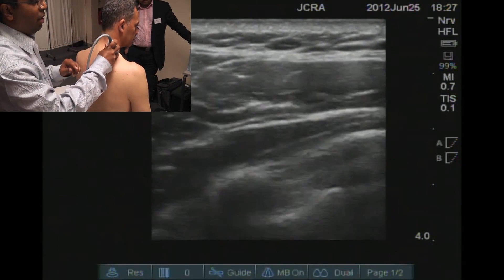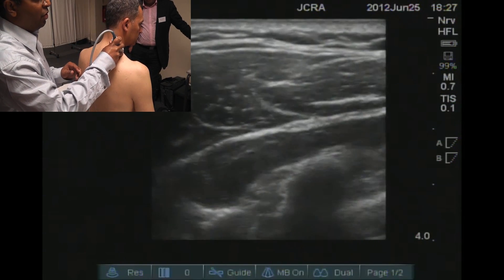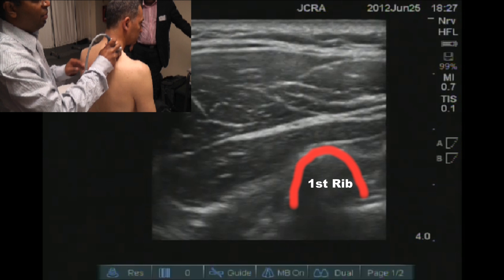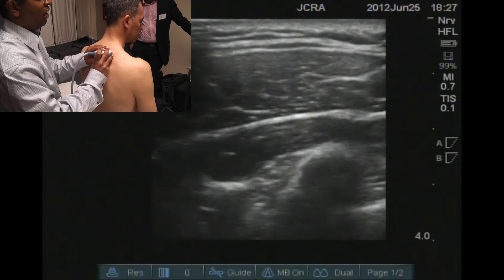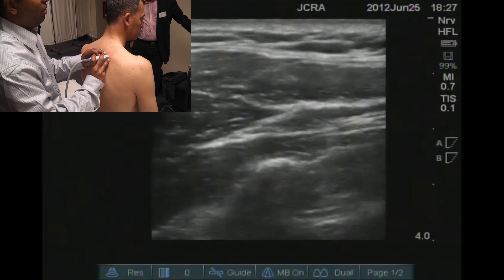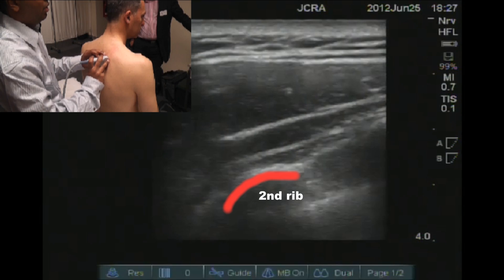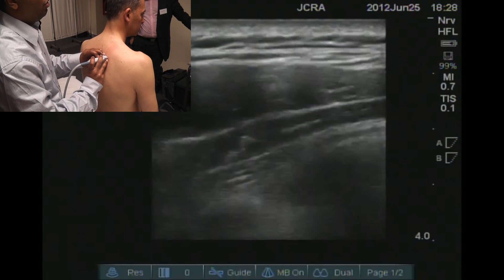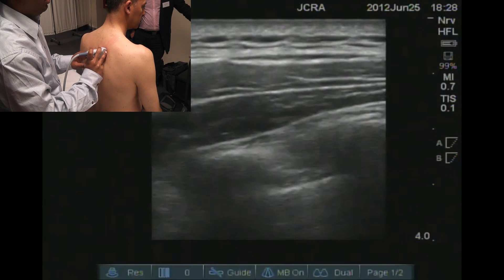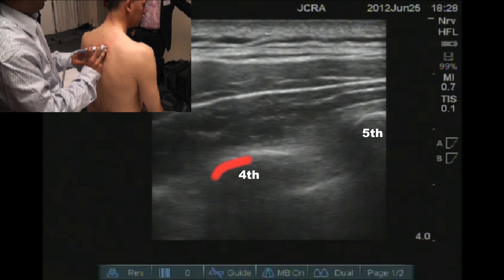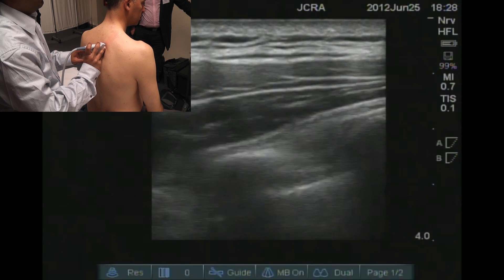Your first intercostal space basically starts counting from the first rib. So first rib, second, then you have the third rib and then the fourth rib. So you choose the third rib, the fourth intercostal space, the fifth intercostal space, and then you work your probe towards the midline.